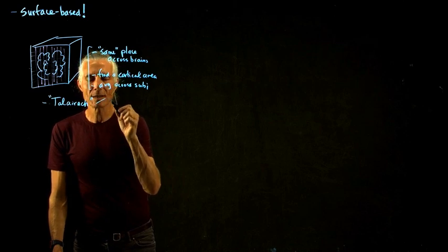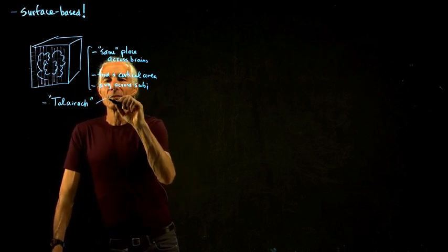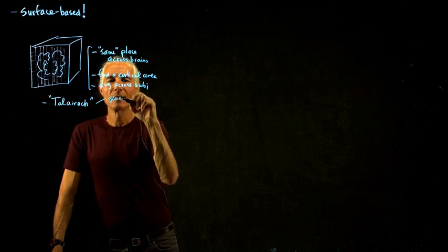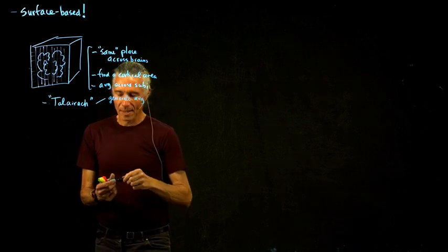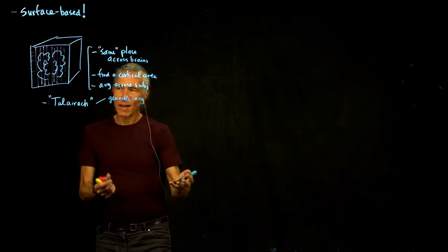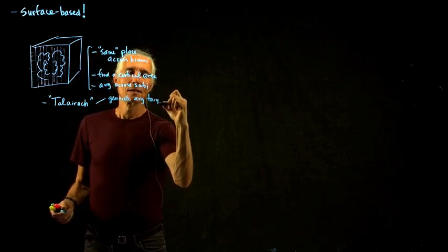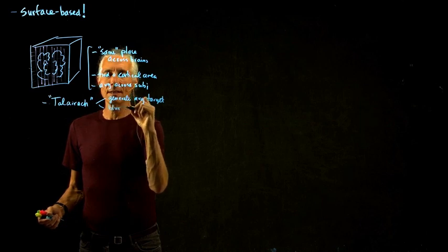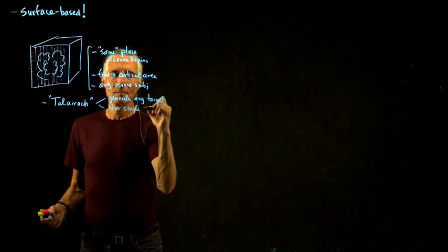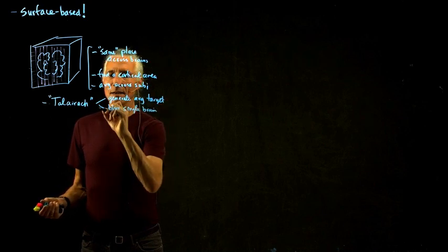And how does this work typically? It might work by generating an average target. So maybe hand align a bunch of brains and then average them. Then blur the single brain, because the average target is going to be a little blurry, and then align.